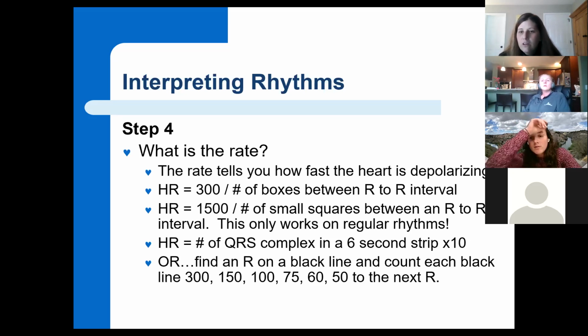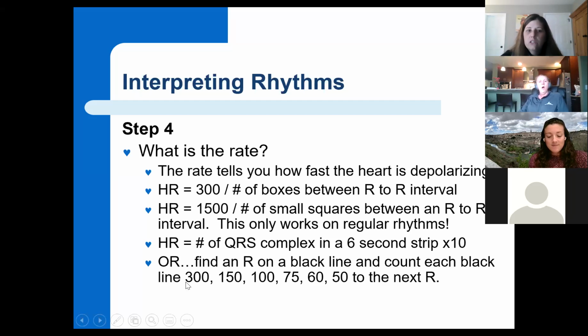That just sounds totally confusing. I know, I can tell by the look on some of your faces. That's okay. It's probably my least favorite, but it is doable. Don't overthink it. But for testing purposes, you need to know all these. But the quickest, easiest one's definitely just getting a 6-second strip if you know for sure it is a 6-second strip and going with it.